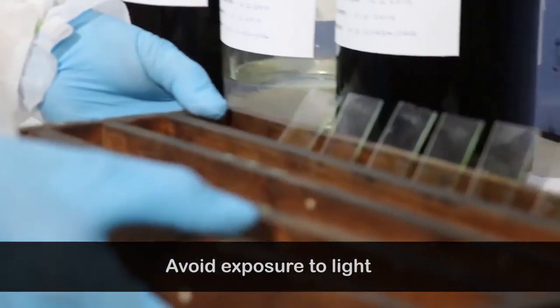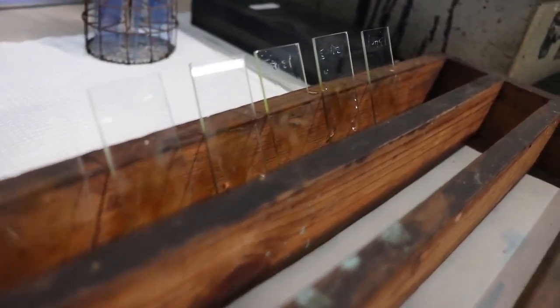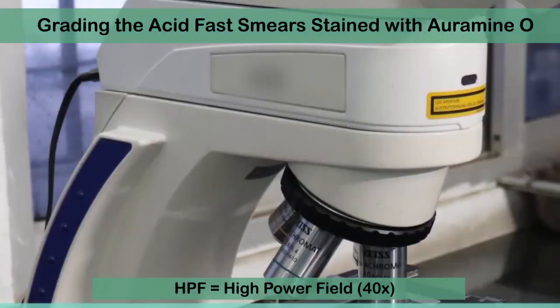Examine the dry slides under a fluorescent microscope within 24 hours of staining. Grading and reporting should be carried out as per RNTCP guidelines. To report smear negative, no acid-fast bacilli should be observed in 100 high-power fields.